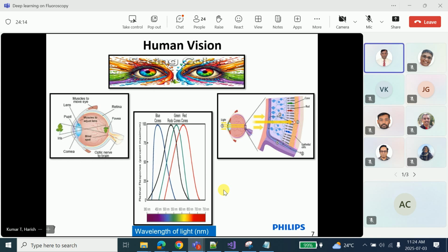Spatial resolution is the ability of the system to appreciate the tiniest of objects. What is the smallest of objects? You don't have to miss any nodules. You don't have to miss any calcifications. You don't have to miss subtle fractures. So if the system has the ability to appreciate this resolution, it has the best spatial resolution. That's why we talk about spatial resolution.